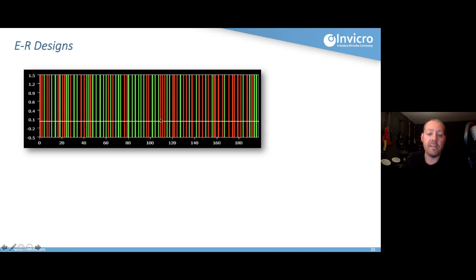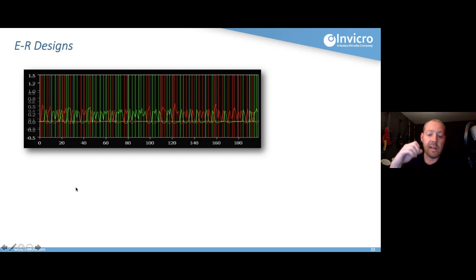And what this does is it gives you an optimally random signal that you're looking for, right? So a bit like I said about the linear summing of responses, when you get 2 red trials really close together, you know you're looking for a big signal. When you get just a green trial on its own, you know you're looking for a relatively small signal, and things like that.